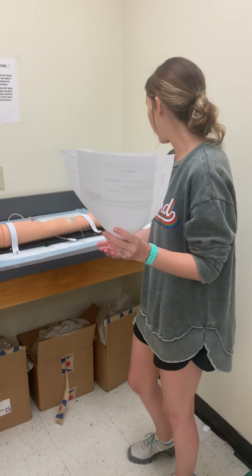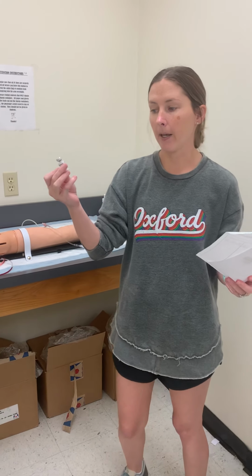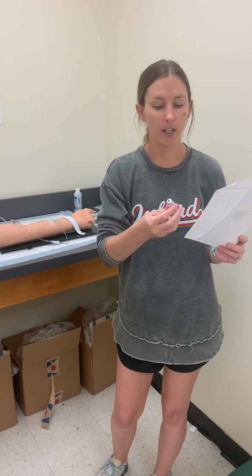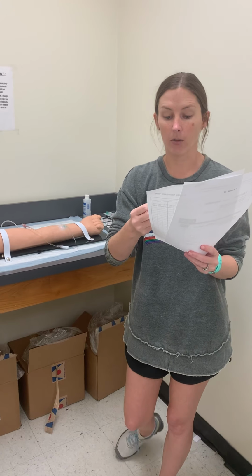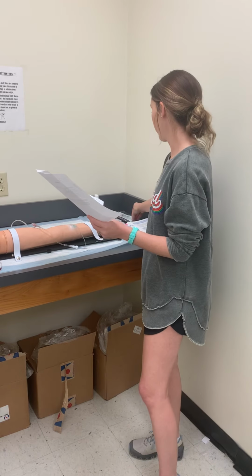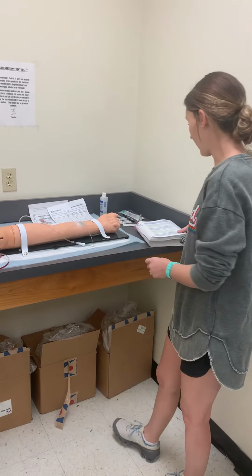So while I'm holding this, I'm going to go ahead and pick up my medication, and I'm going to compare my medication to my MAR. So I'm making sure I have the right medication, and I'm also making sure that my medication is not expired. So I'm checking the expiration date, and the expiration date is 1 year from now, so we're good to use this medication.